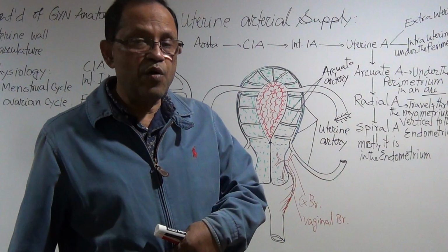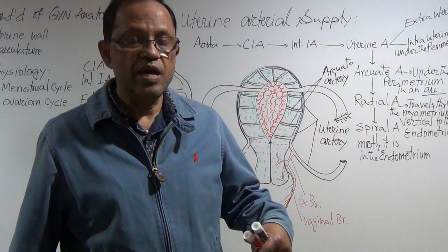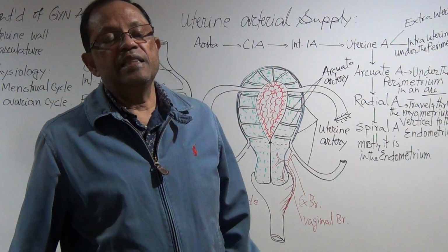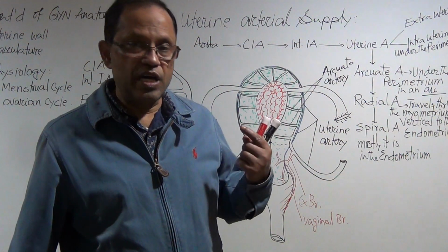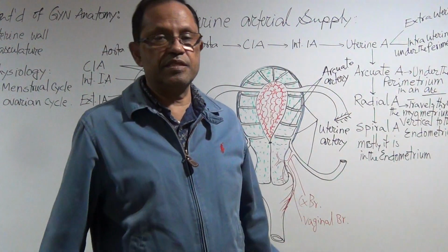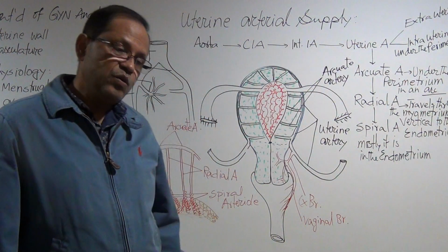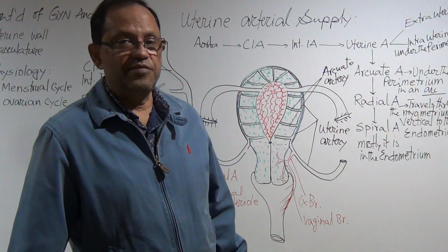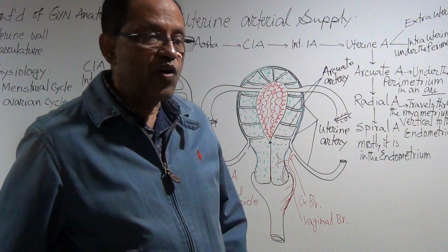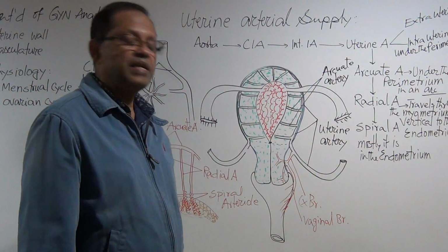I said para-aortic, also paracaval too, around the IVC, around the aorta. And we need to check also the lymph nodes at the porta hepatis area, and then we need to check the liver for metastasis.